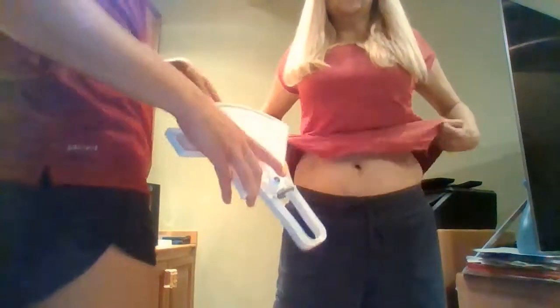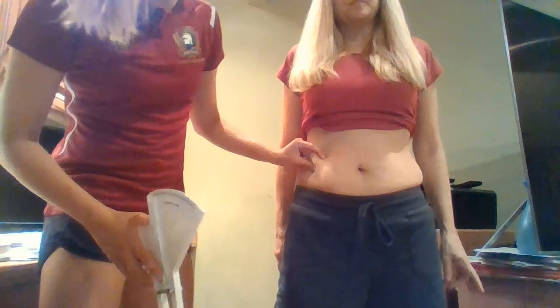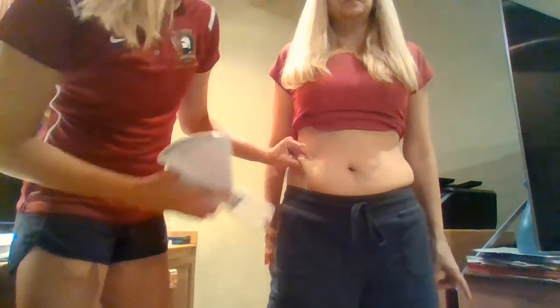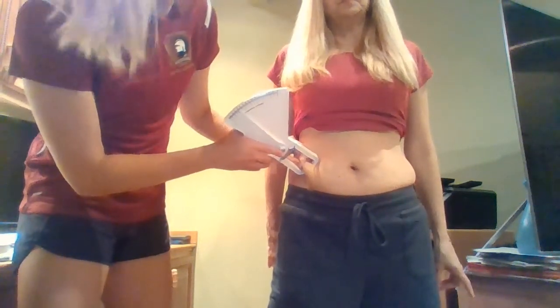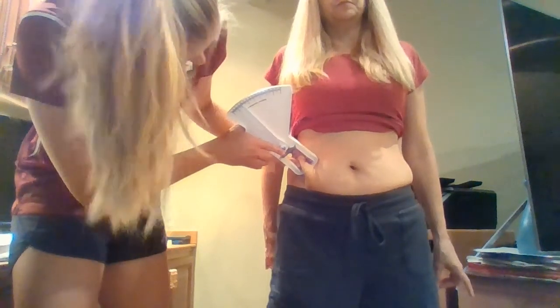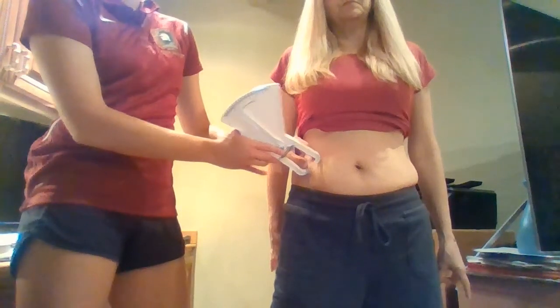All right, now you're going to turn around and we're going to measure that suprailiac measurement. So we're going to grab, once again, the diagonal is here, so I'm just going to grab with that diagonal, making sure not to grab any muscle. And I'm putting that right at the middle of that muscle belly. We're sitting right at 18 millimeters on this measurement.